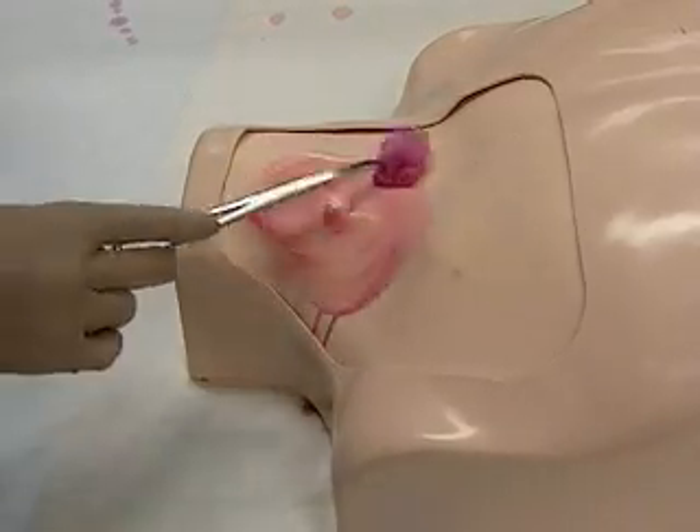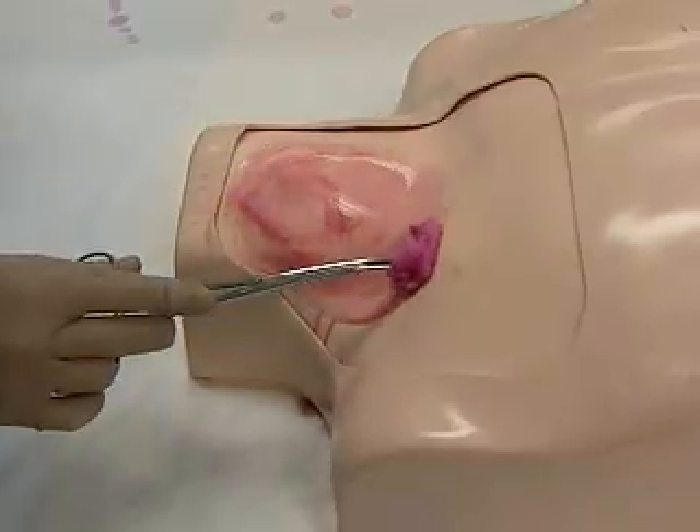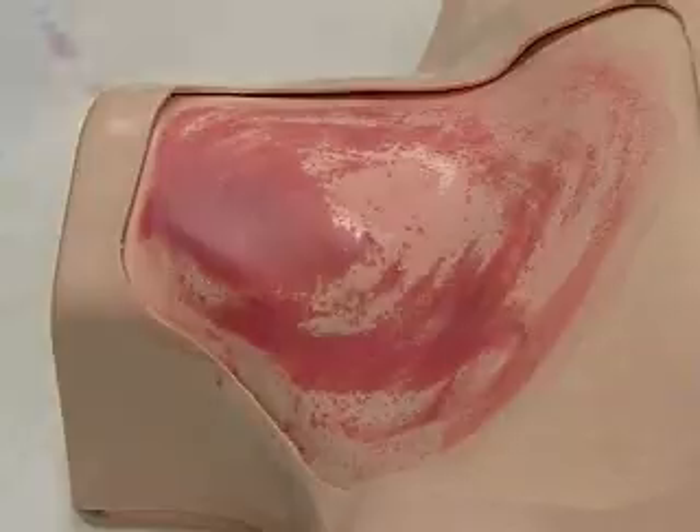We prepare the skin surface by wiping with antiseptic, circling outwards once, twice, and a third time.